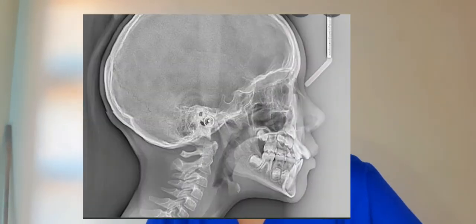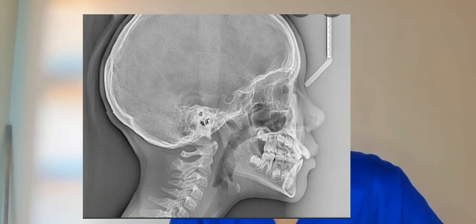You guys have done anatomy, you're still doing anatomy, so please just correlate it. Like with our sella, that would be the center of our pituitary fossa, and the nasion being the most anterior point on the frontonasal suture in the mid-sagittal plane, and so on and so forth. So please familiarize yourself with that as well. That's basically what the next couple of slides are showing you.